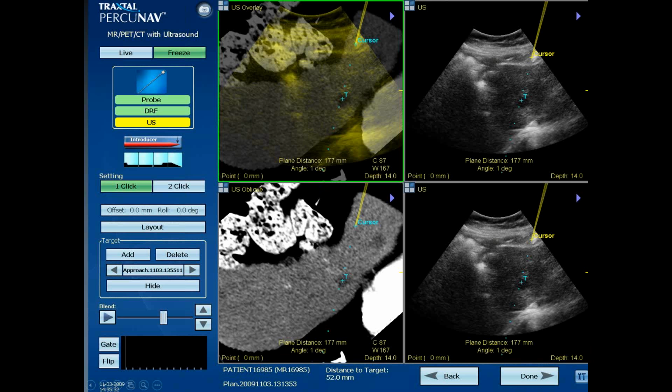But what navigation does is it's producing and projecting an image of the virtual needle into the target or along the target, which you have identified on ultrasound or CT before. And you kind of superimpose the CT image on the ultrasound image right here. And then you can navigate the needle, which has a tracker obviously, into the target, regardless if you see the target in real time or not. So if you have an ultrasound guided procedure where you don't see the target, you can still go through what you see with CT. So it's an artificial live CT image superimposed on the ultrasound.